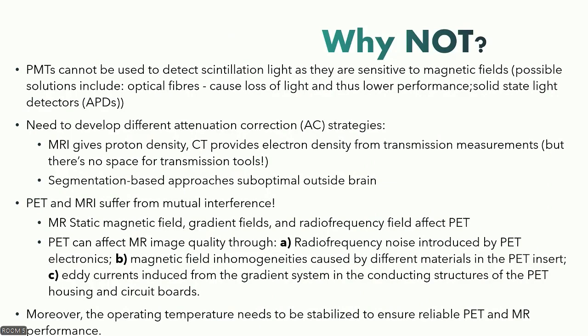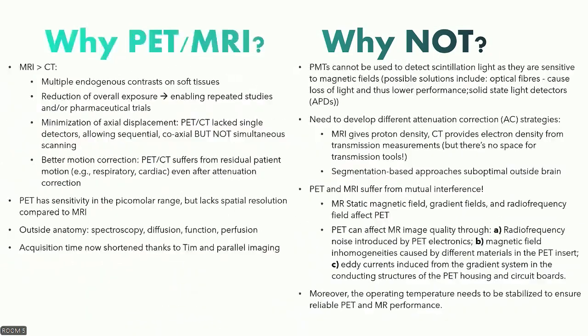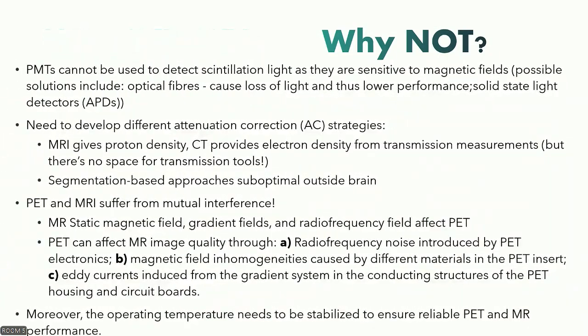The point is basically PET and MR disturb each other due to their very intrinsic characteristics. And as you can imagine, the bare existence of the PET ring inside the MR scanner is a source of noise and inhomogeneity. And I can tell you, if you don't have a very good coil, your MR images in the PET MR scanner won't be top, let's say like that. The neuroradiologists will have their word on it. But the point is that the acquisition coils must be PET transparent to guarantee the simultaneous acquisition of both modalities.